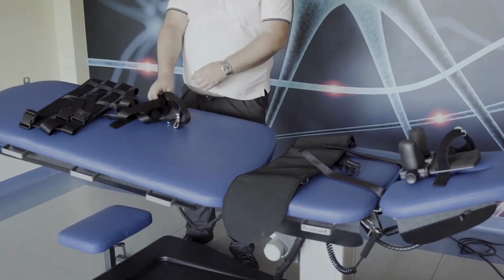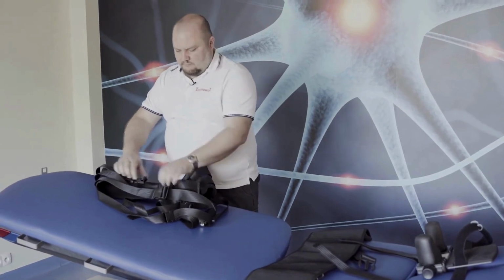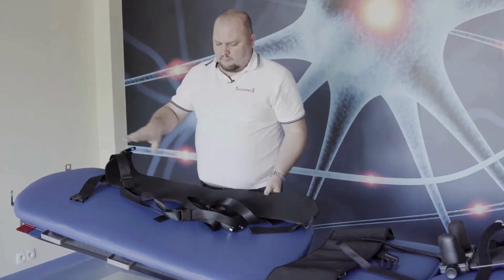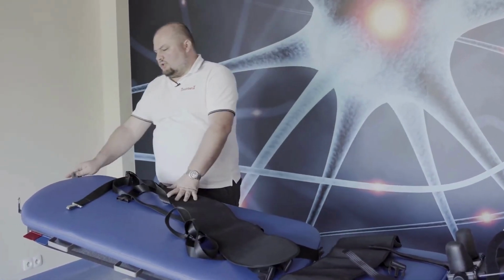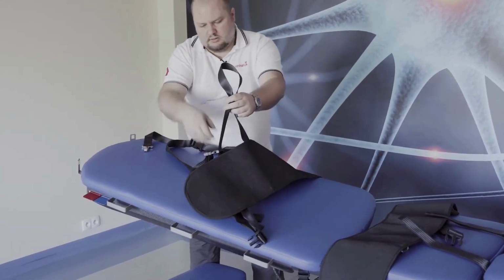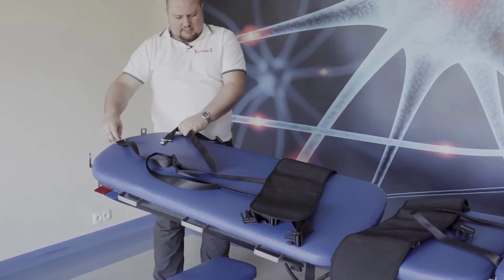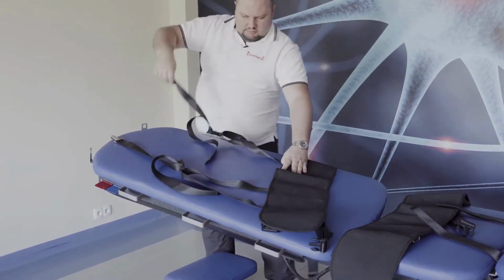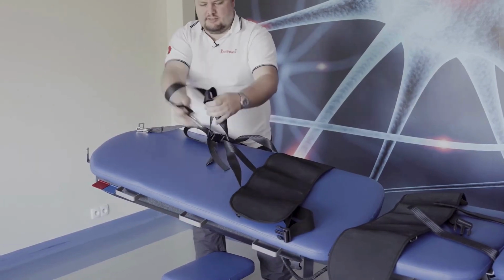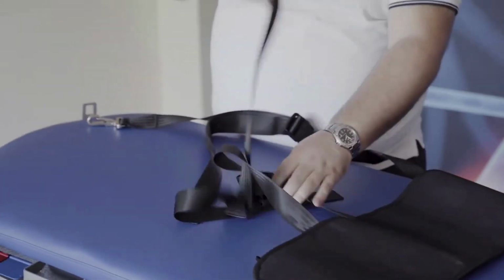Lumbar belt, attached to this place, like we said before. What is important is to make sure that those belts are not turned, squeezed, or in any other place in a knot.